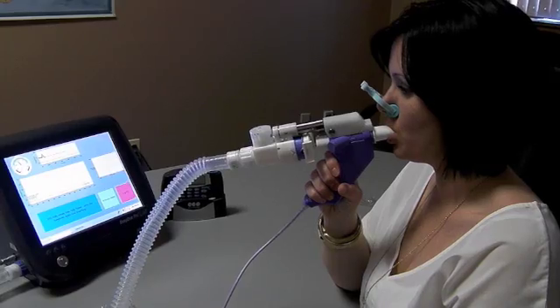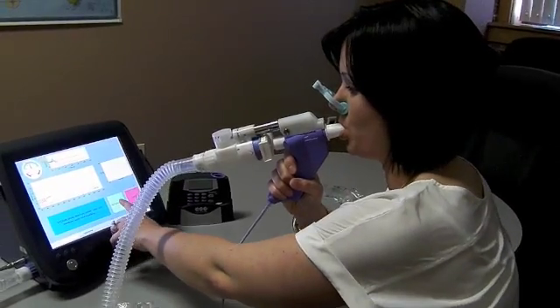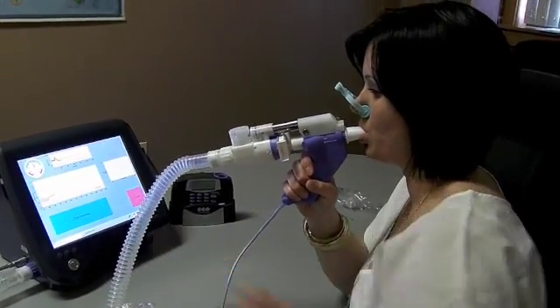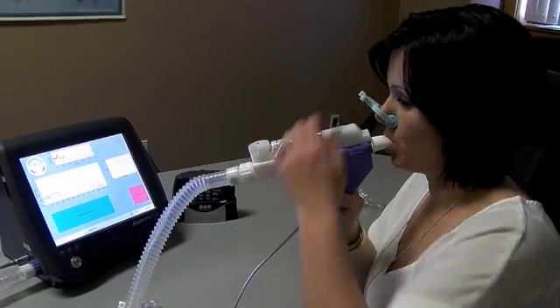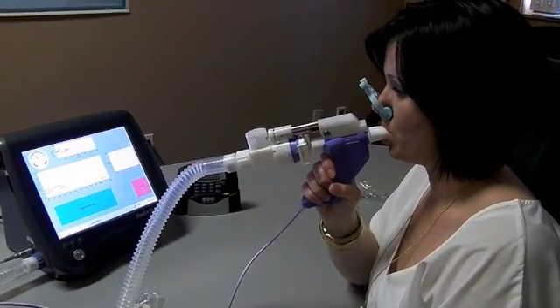Now exhaling, completely fully exhaling. When she starts, we'll activate the test, and now the machine is set. After five tidal breaths, it will start nitrogen washout.